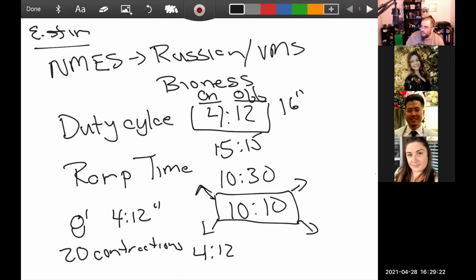What did we do for, I remember for my comp, I did 5-5. What was that option again? Oh, okay, there is a 5-5. I forgot the machine. These machines have a 5-5 option. Yes, that's the duty cycle. That's all that is. I'm so used to the machines I've worked with at the clinic, they usually don't have a 5-5 cycle. That's great.